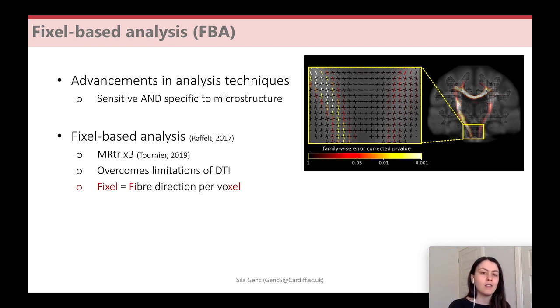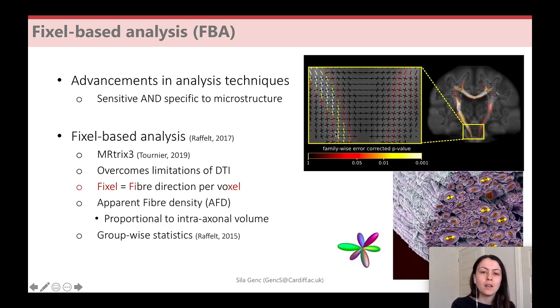as rather than taking some average value over a voxel, we can get fiber-specific information, and particularly when we're performing group comparisons, we can look at specific fiber pathways that may be changing between groups or even along dimensional variables or continuous variables.